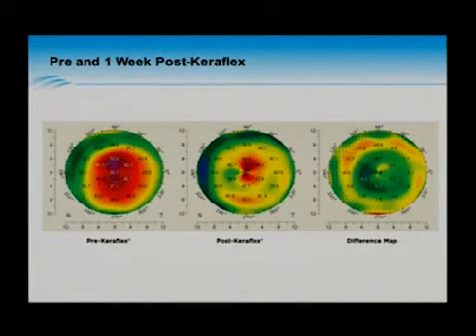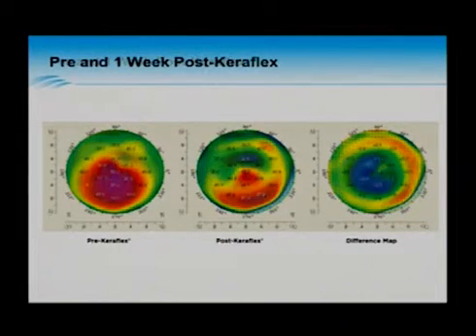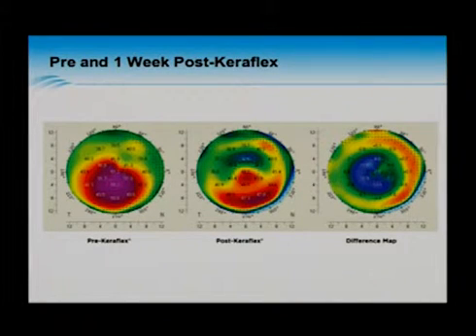Here's a patient with a mild cone. You see the pre-op, post-op, and then a difference map on the back with the nice annular flattening. Here's a more dramatic cone. You can see from the difference map, there's excellent flattening of the cornea. What's interesting with this device, although the treatment is annular, you tend to get an increased effect in the steeper areas and less of an effect in the flatter areas, which is of course desirable.